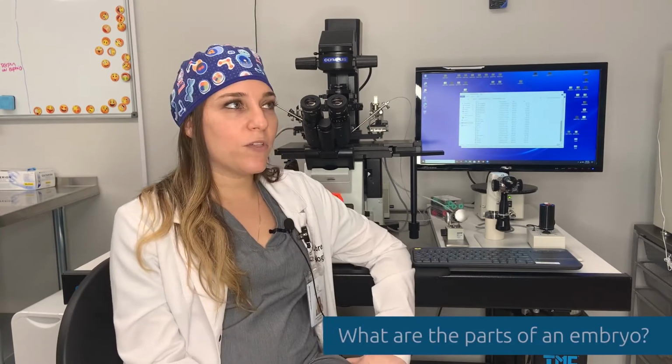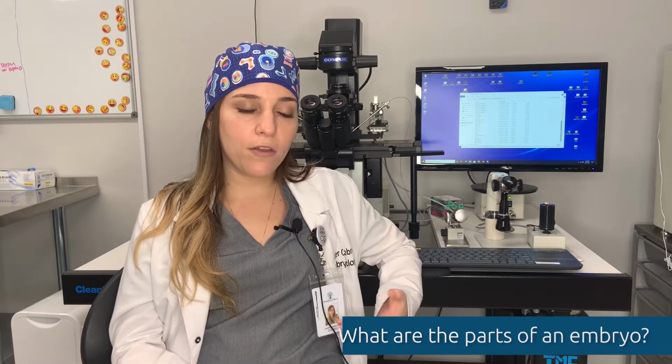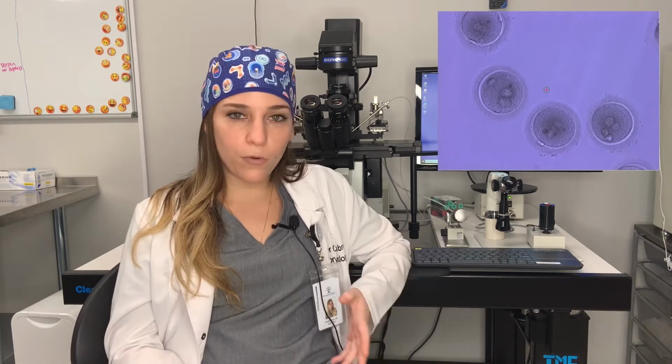Depending on what day we're talking about, there are multiple parts of an embryo. Starting from, I would say, the most distinguishing part, day 1, which is fertilization check. We want to make sure there's presence of 2 polar bodies on that oocyte and the presence of 2 pronuclei. So that's basic for day 1.